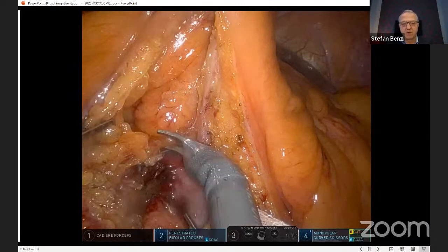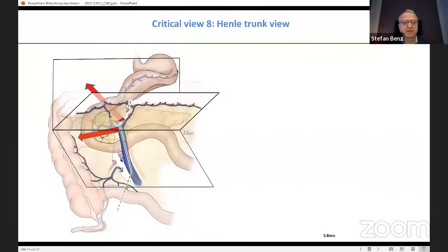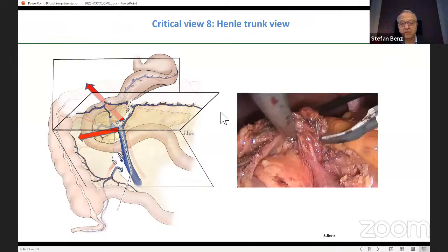And then the whole specimen is anteriorized with the Henle trunk veins. So now we look for the anterior aspect of the Henle trunk and dissect in a medial to lateral fashion all veins that run into the Henle trunk from caudally and anteriorly, but leaving the gastroepiploic vein. That would be critical view number 8, anterior aspect of Henle trunk.